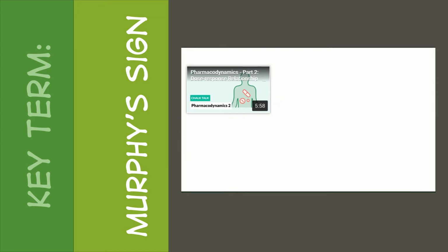So you're actually going to be able to do the same thing with your transducer. When you have the gallbladder imaged on the screen, you're going to be subcostal to where that location is. You're going to have them take a deep breath, watch that gallbladder slide underneath the pressure of your transducer. If they take a sharp breath in or stop breathing in, that indicates a positive Murphy sign. So you're going to want to make sure that you are indicating that on your worksheet.